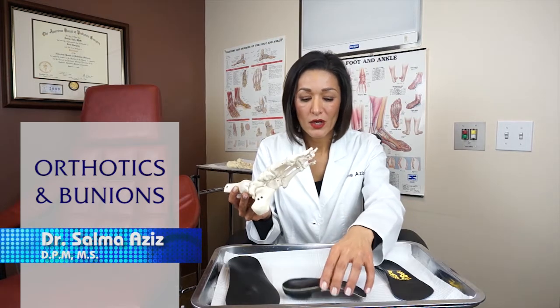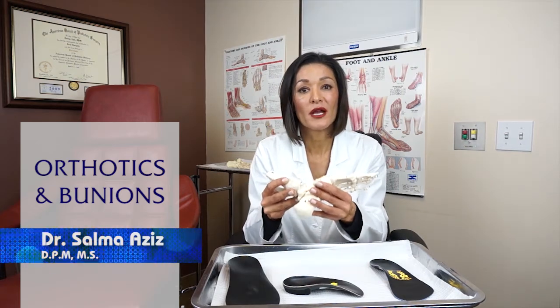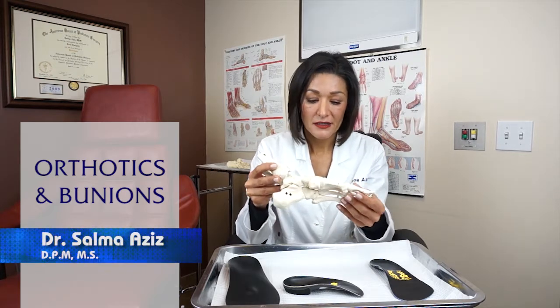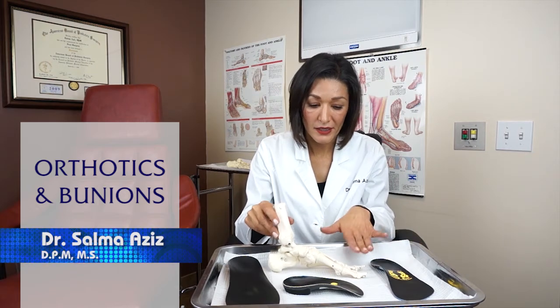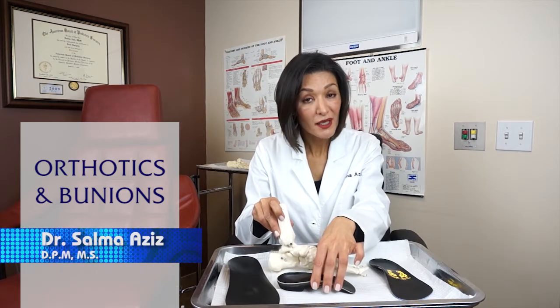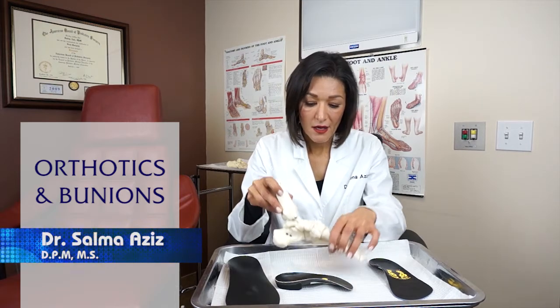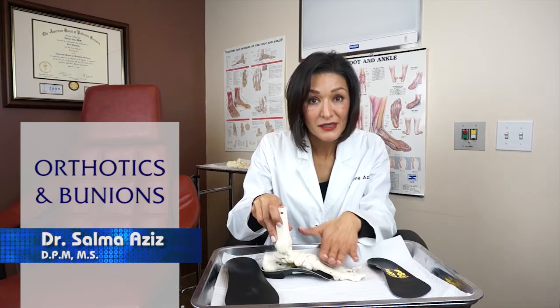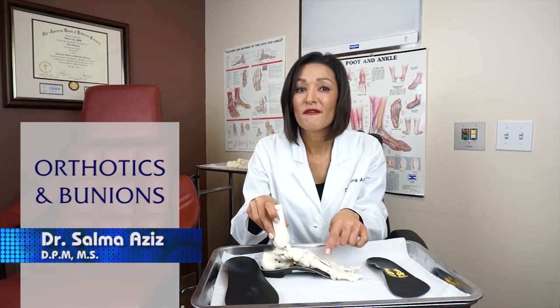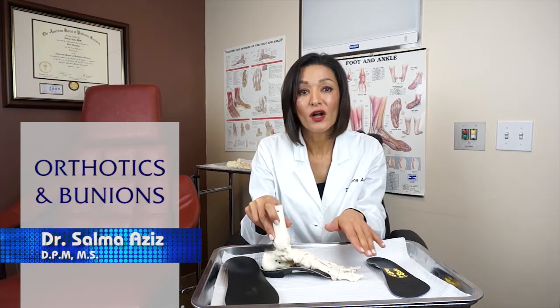Well, how? As I said before, an orthotic controls the mechanics of a foot. It puts this foot in a more anatomical position to make this a better functioning machine. And since we said people that suffer from bunions often have arches that collapse, therefore leading to this bunion, if we make an orthotic that maintains this foot and ankle in that neutral position, as I demonstrate, where the foot and ankle is not collapsing, then what we're able to accomplish is we are making this big toe joint function better, thereby either slowing down the progression of the bunion or completely halting it.